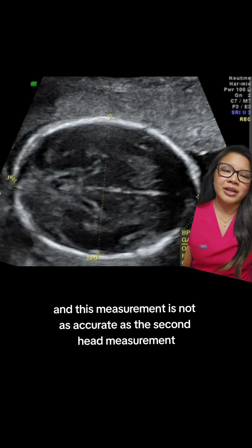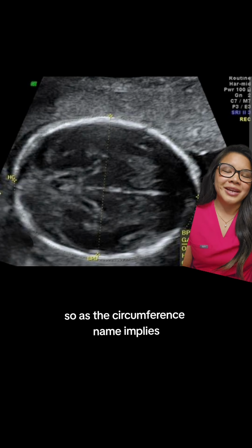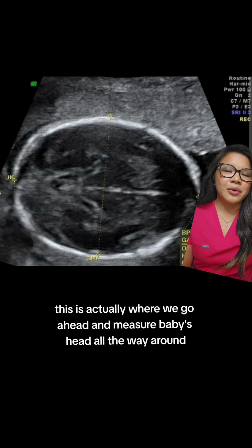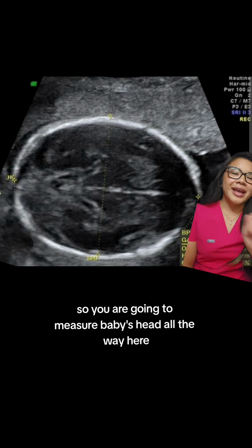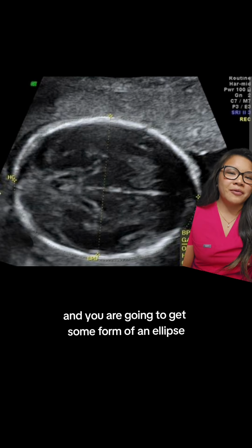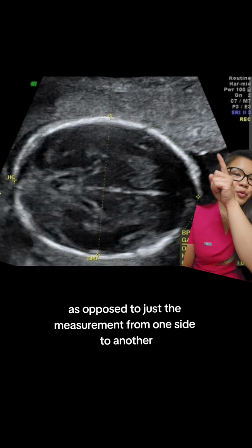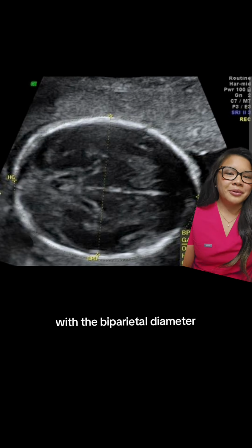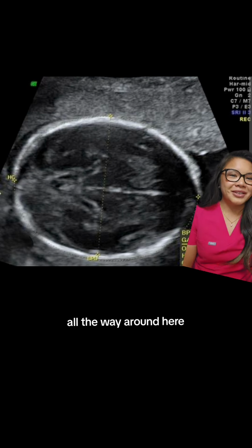And this measurement is not as accurate as the second head measurement, which is a head circumference. As the name implies, this is where we measure baby's head all the way around. So you are going to measure baby's head all the way here, and you are going to get some form of an ellipse, as opposed to just the measurement from one side to another with the biparietal diameter. The head circumference is going to be measuring the head, again, all the way around here.